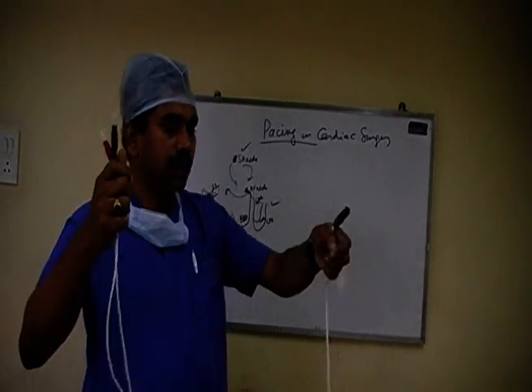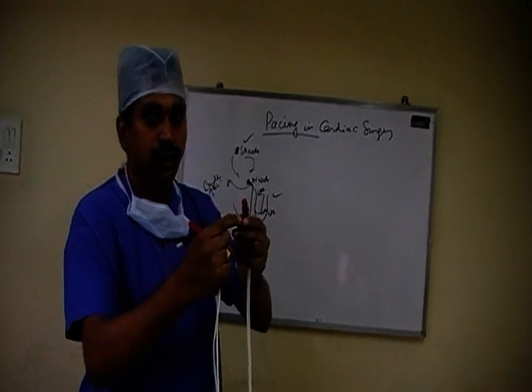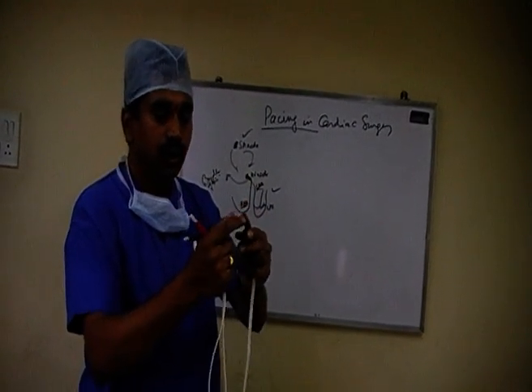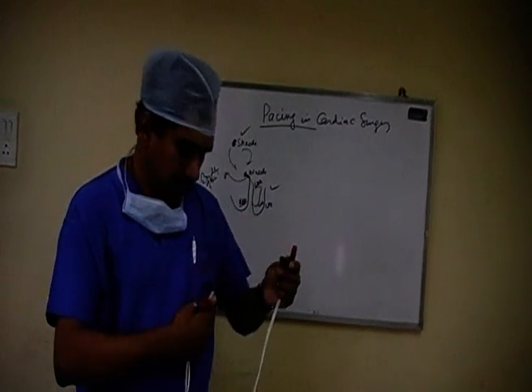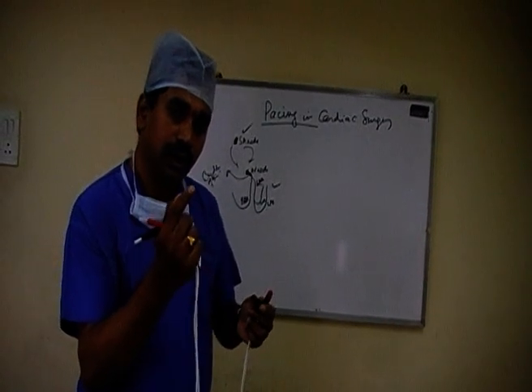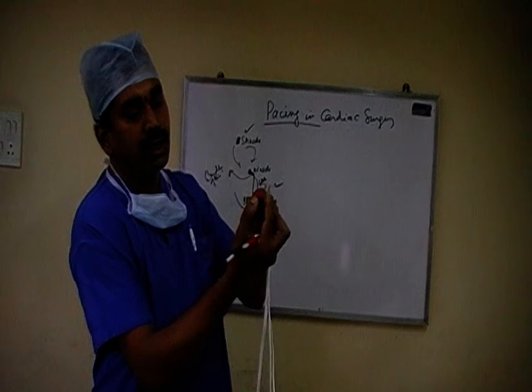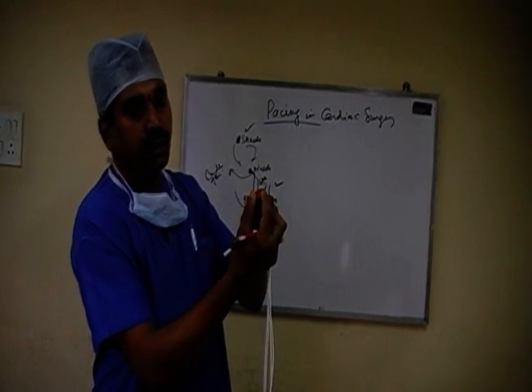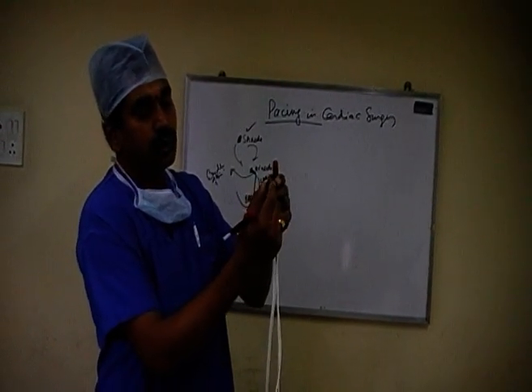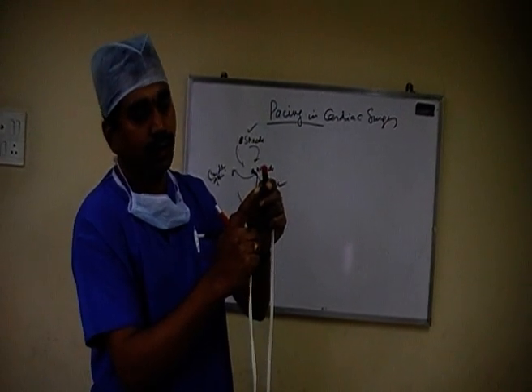And so these have corresponding ends where the needles of the pacing wires can go. So whenever you need to pace a patient, there will be a couple of wires coming out of the patient, and at the end of those wires there are needles, blunt needles, which go into this end. And once the needle is placed, then you can tighten it so that the needle will not come off easily. And so if you have two pacing wires, you put the two needles into each of these.